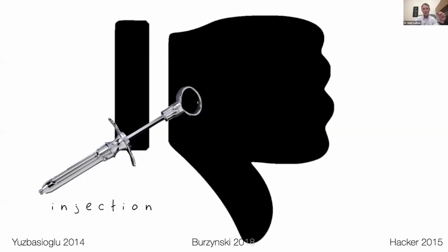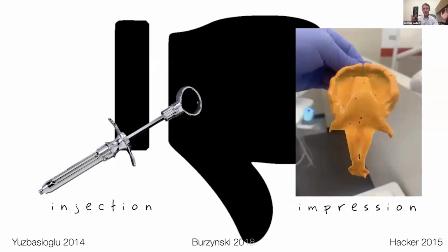But what's really interesting about this, if you look at the number 2 on the list, that's honestly in the same order of significance on the list, is the impression. Now look, this is a true prosthodontic impression right here, okay? If you're not border molding the primary bronchus, you're doing it wrong, okay? And I say that in jest, but the reality is this is sort of what the patient is hoping doesn't happen and they think is going to happen to them. It doesn't matter if you've never done this ever in your life before. This is what the patient's experience is when you're coming at them with a loaded impression tray.